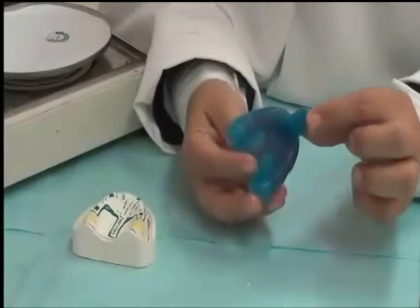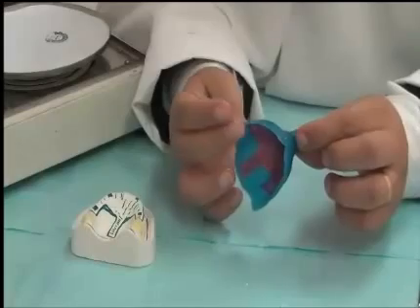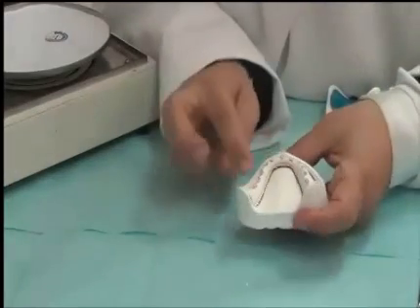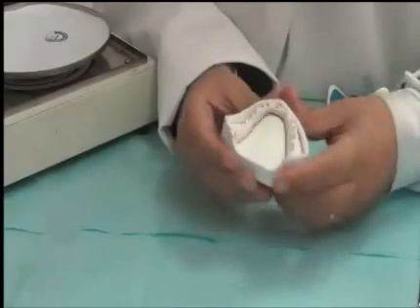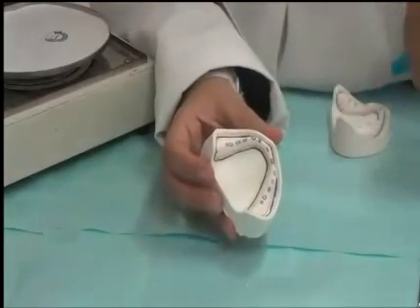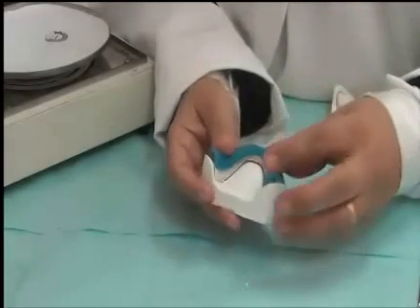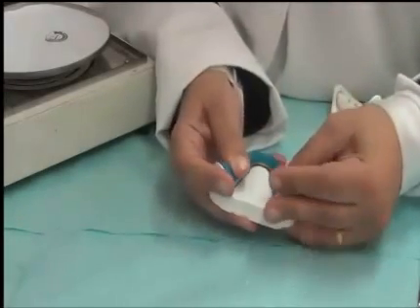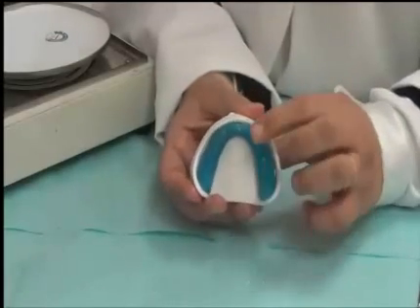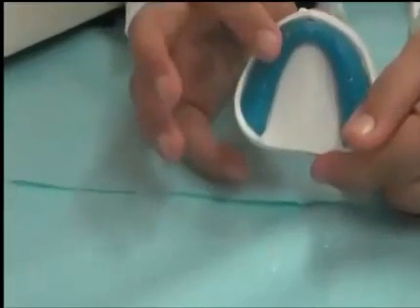So this is for the upper. We're going now to do the trimming step. For the lower, you have drawn the outline, and then the outline of the tray. Then we're going to adapt the tray light cure material over the tray immediately and light cure it. And we're going to place the holes in the light cure material or acrylic base material before curing it.